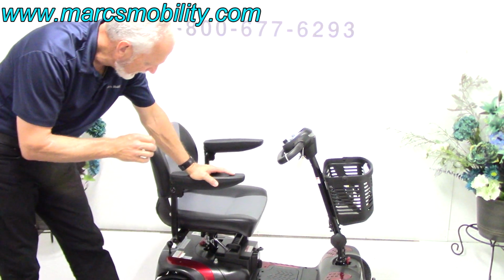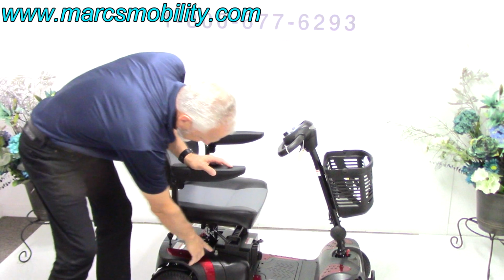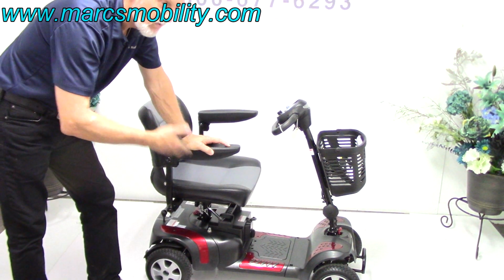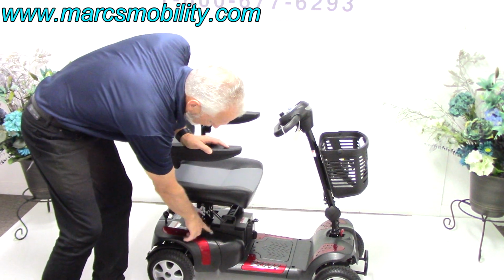So let's recap. Well, one thing I didn't show you is the reset button is here. So if you ever got in trouble, you got stuck in the mud, instead of burning your motor, this would pop and you would pop it back in.